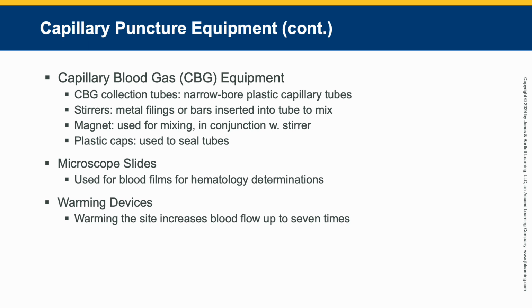Make sure you document somewhere that the main reason we use warming devices is if you are doing a heel puncture on a newborn. If you are looking in your book, you can look on page 357, figure 10.6. That is a picture of an infant heel warmer. These are made by a manufacturer. You want to make sure that the device does not exceed 42 degrees Celsius.